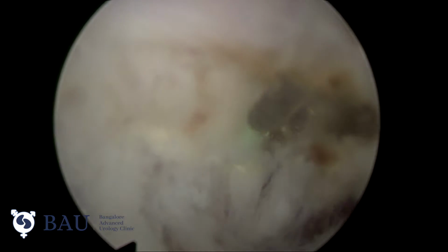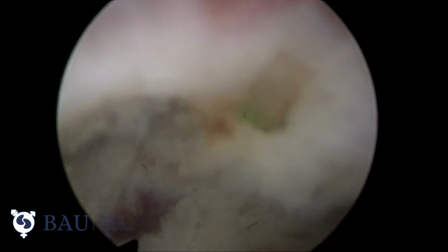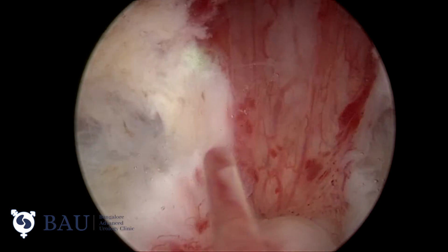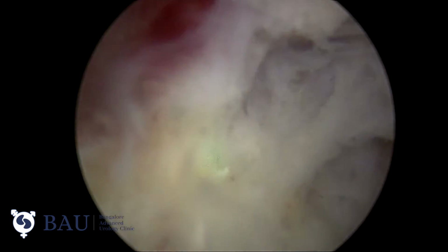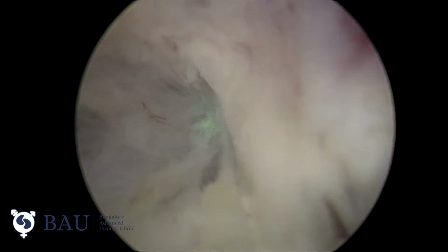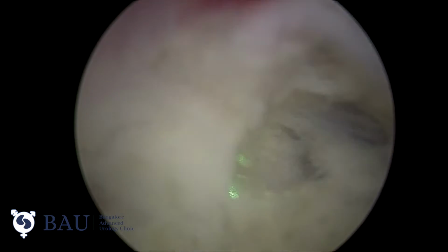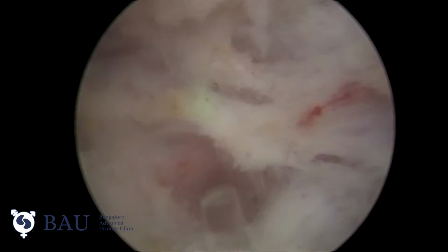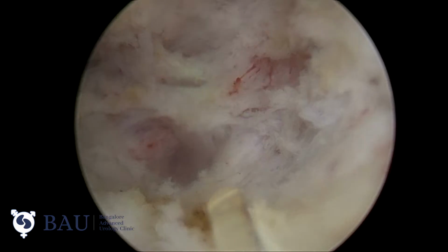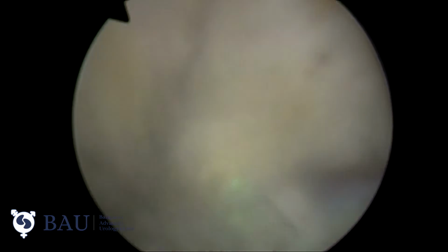Create a little bit of plane in the anterior part. Now at the end, we cut the verumontanum from the mucosa over the prostate. Now you can clearly see the plane, and you can proceed with the dissection. Here we need not put any pressure. Just cutting the flimsy layer, we can proceed with the dissection.